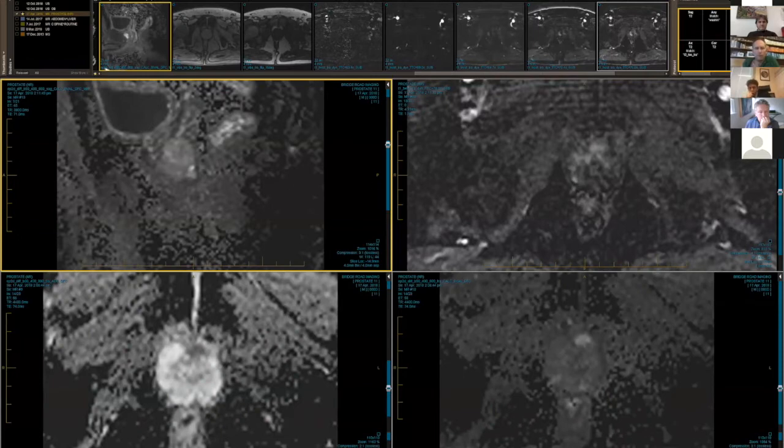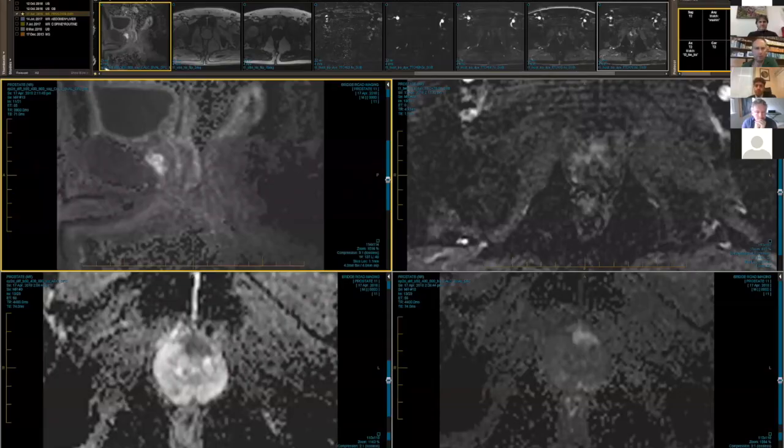So, Francesco, what sort of biopsy would you do for this chap? Honestly, in our center, we use just a transrectal. That is a little limit, I guess, of our center. So we just perform transrectal fusion biopsy. Probably I would go for a transperineal in this case. I didn't see how anterior it is, but... Yeah, it's pretty anterior, but it's not a big gland, so it's probably not going to be hiding behind the pubic bone too badly. Can you see that? So it's very anterior.